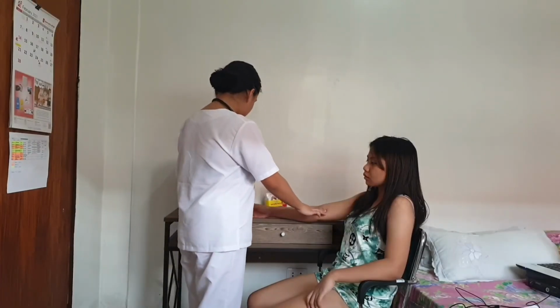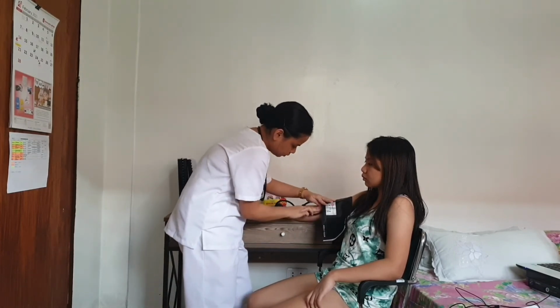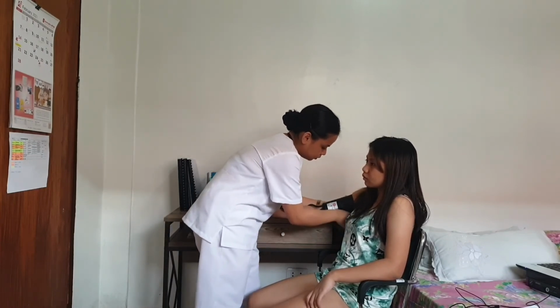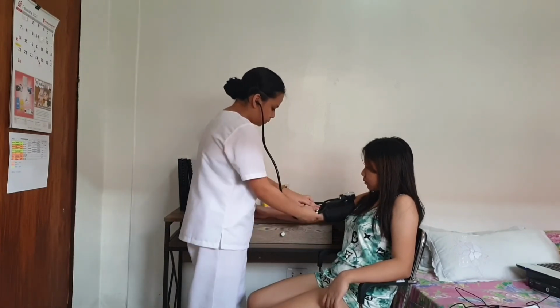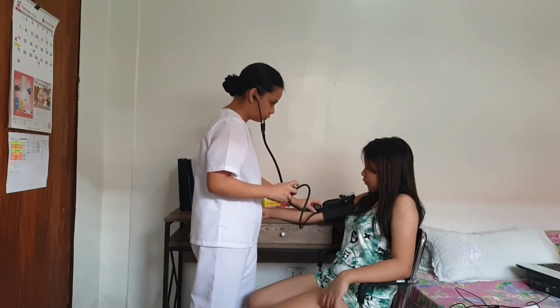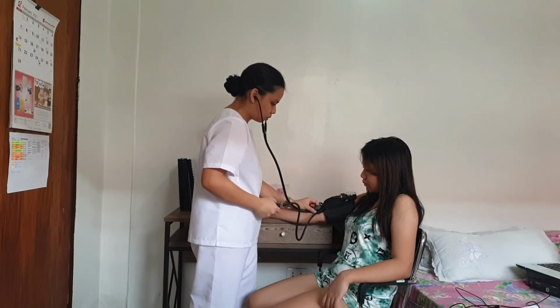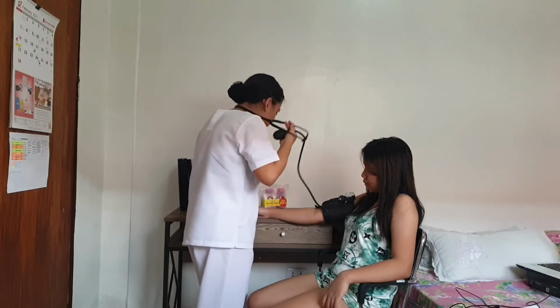Okay, so from my reading, my first reading was 90/70 and now it is 90/60.